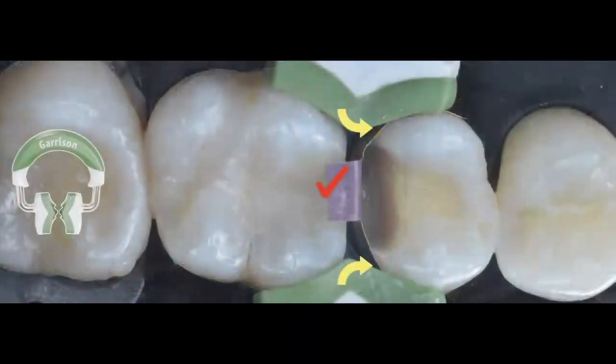In a case like this, a good example of what I would select would be the wide prep Garrison band, as you are seeing here in this photo. This band has one positive thing. As you can see, the prongs of the band are much wider, so they will engage with a lot more tooth structure, mesial and distal, to the box that you're trying to restore. On the downside, this band will create less pressure between both of the teeth, so there will be less separation of the teeth gained by this type of band.